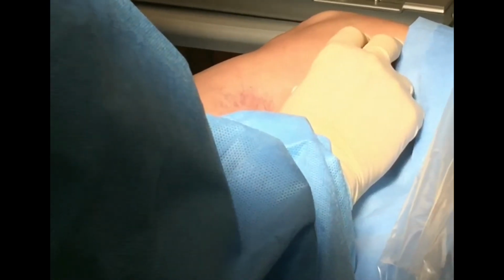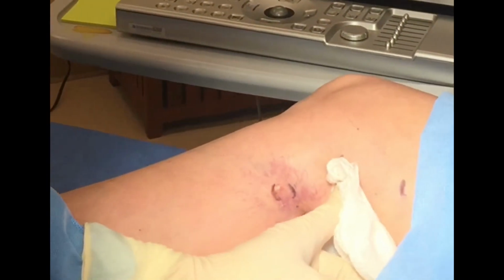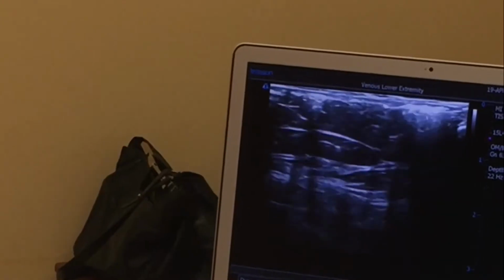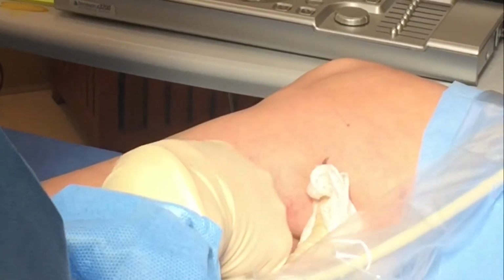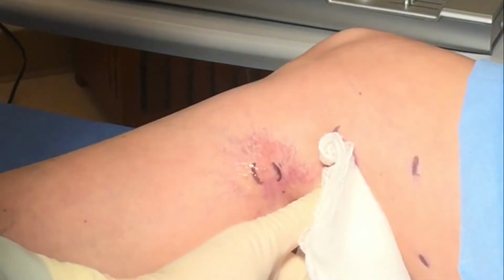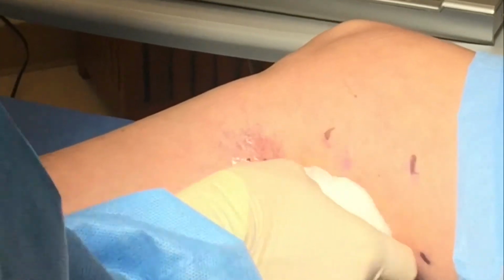So now I'm going to take a look here. I made a mark on her skin where there was a tiny varicose vein right in the middle of those spider veins. So let's see if it's filled with foam. And it has. Look at all those speckles at the top of the screen. So you can see from that one injection site, we were able to fill the varicose vein around these spider veins as well as the feeding branch coming all the way down the thigh, all from one spot. Great.